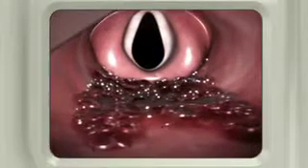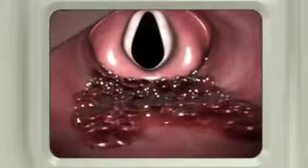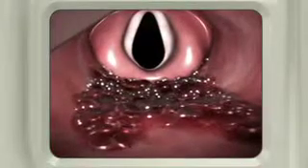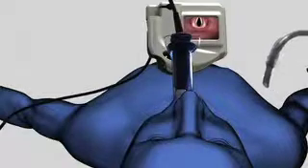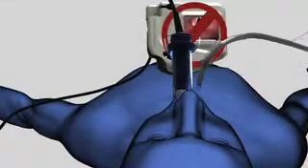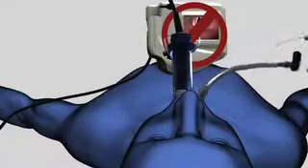The video image of the glottis when using the Glidescope videolaryngoscope typically is a Cormack-Lehane Grade 1 or Grade 2 view. The user may be tempted to immediately insert the endotracheal tube and try to navigate it through the glottic aperture while continuously looking at the video screen.